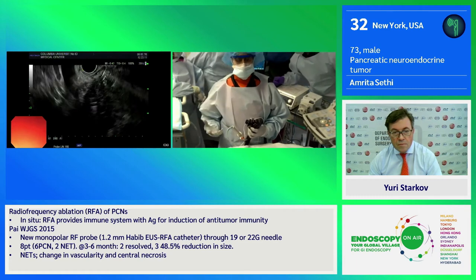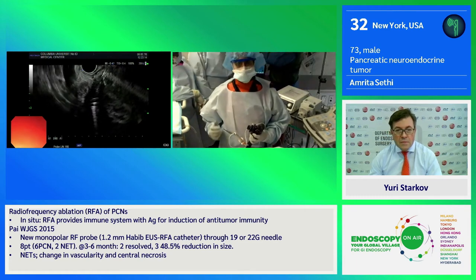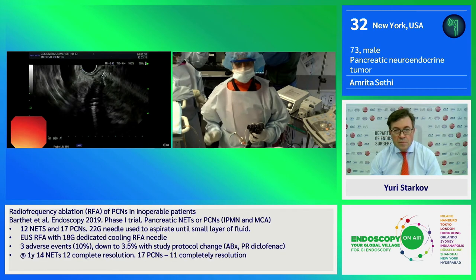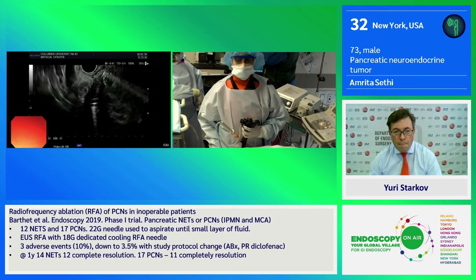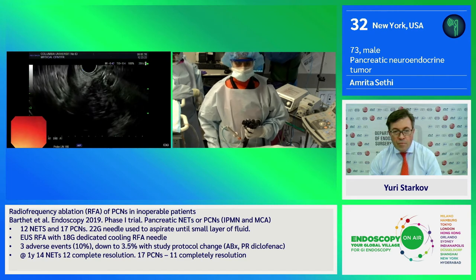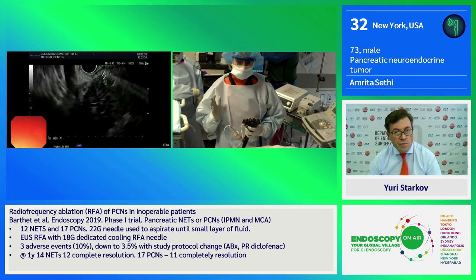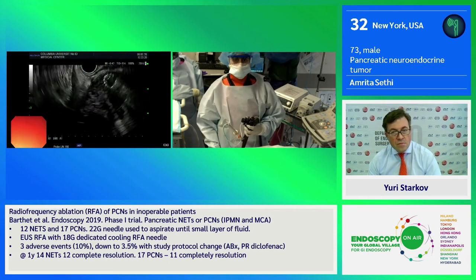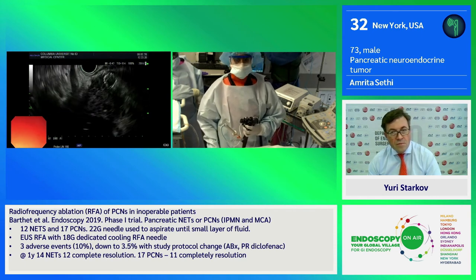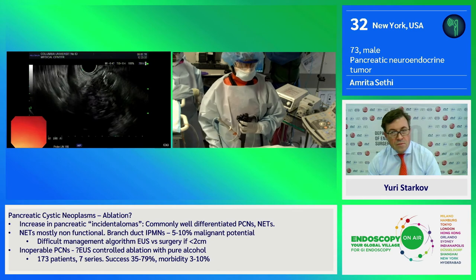If it is possible to do two applications, that would be ideal. However, in this situation the positioning is difficult. The area of effect of the treatment is about 9 mm, or a little bit less, by 15 mm. So placing it here, we will be able to treat a portion of this lesion.